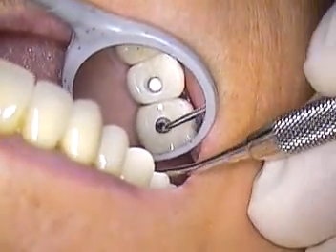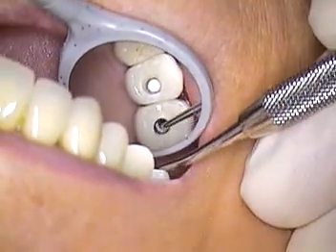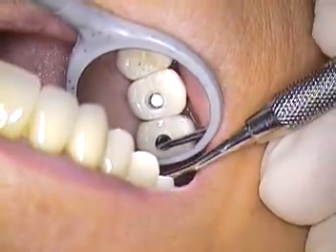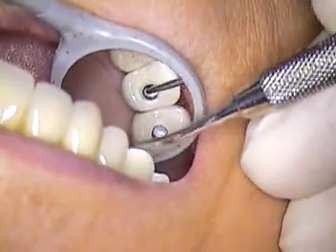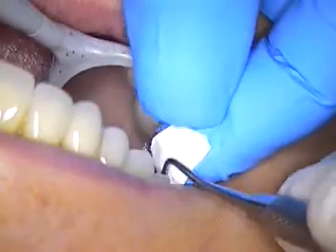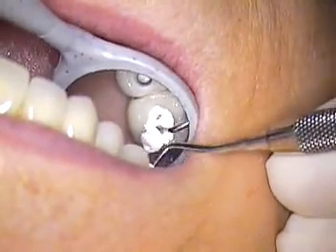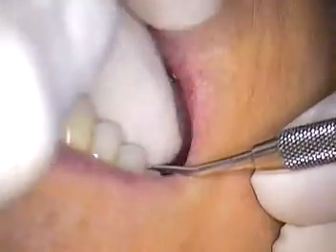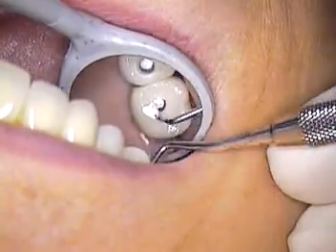If you guys are dentists out there still using condensable composite, this is pretty close to that. I'm going to put a little bit more in there on this one molar. It's nice and tuckable — it just seems like we're tucking in a shirt sleeve or shirt tail.